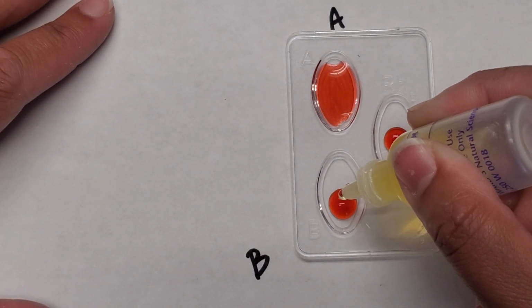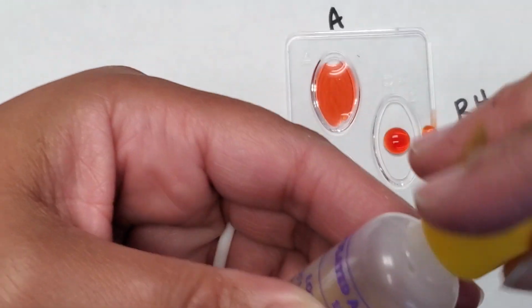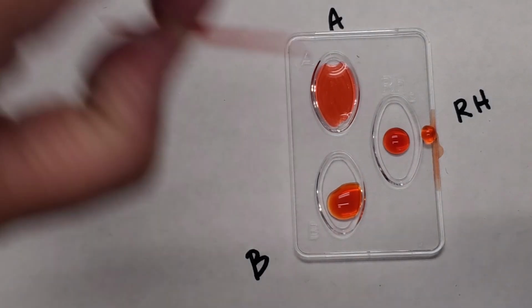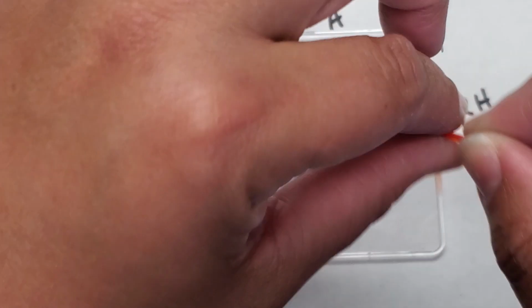So again, if the B antigen is present, this anti-B antibody is going to bind to it and attack it. It is going to cause it to clump. It's going to cause it to agglutinate. So again, we're going to mix that sample.